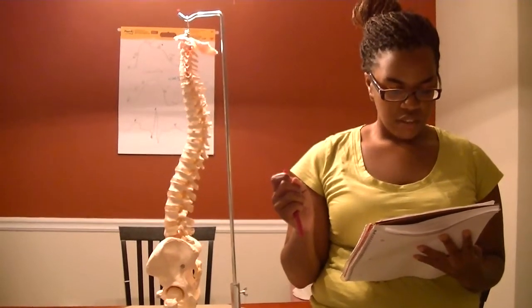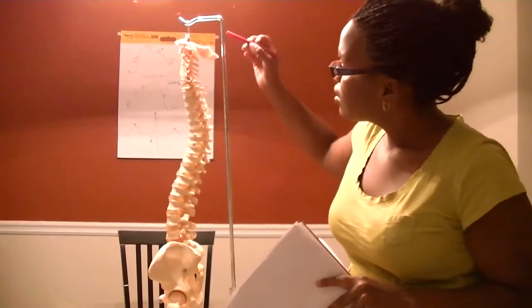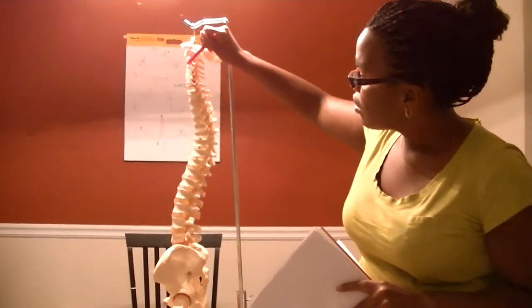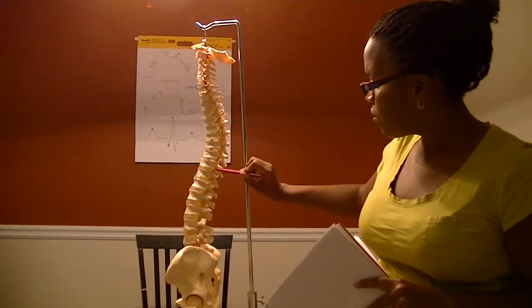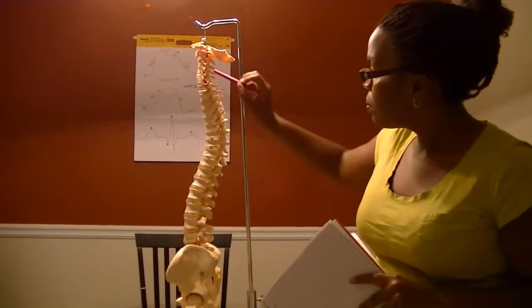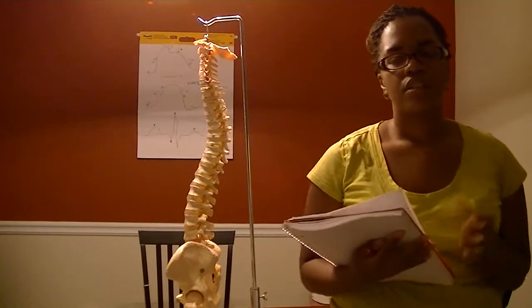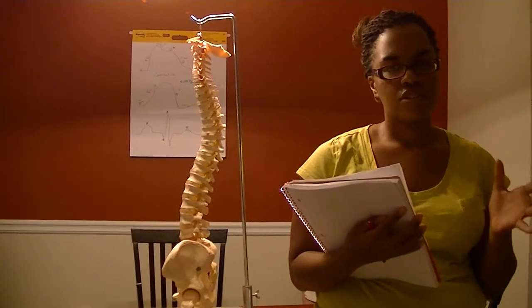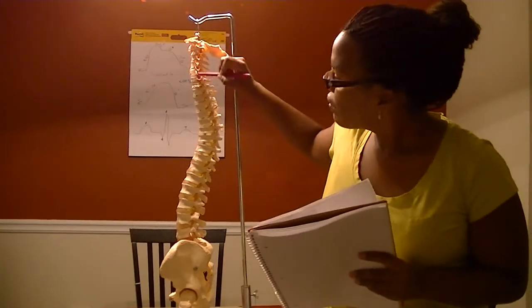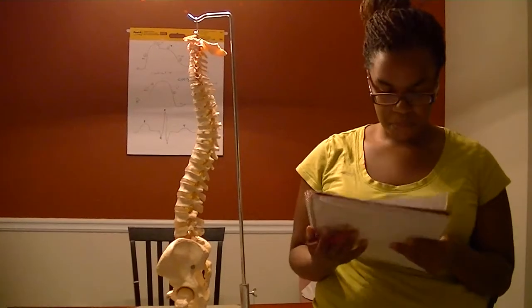The next landmark that we talked about was George's line. And George's line is drawn along the posterior aspect of the vertebral bodies, as what I'm showing with my pen right here. So posterior aspect of the vertebral bodies, and that's going to show the integrity of the cervical spine. So we don't want any breaks in the George's line. We don't want one of the vertebrae to be shown as going more posterior than the other. We want a smooth curve.